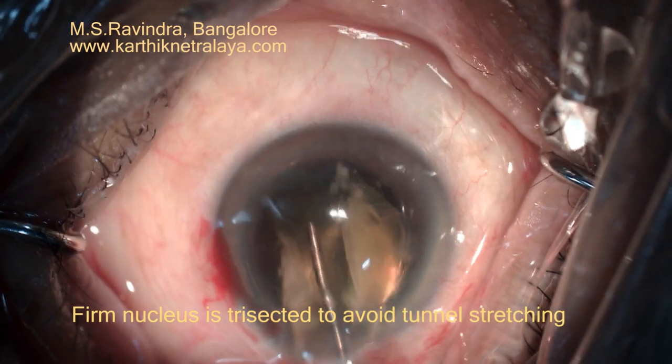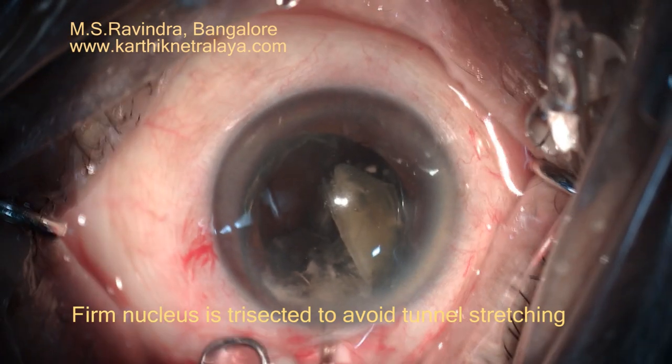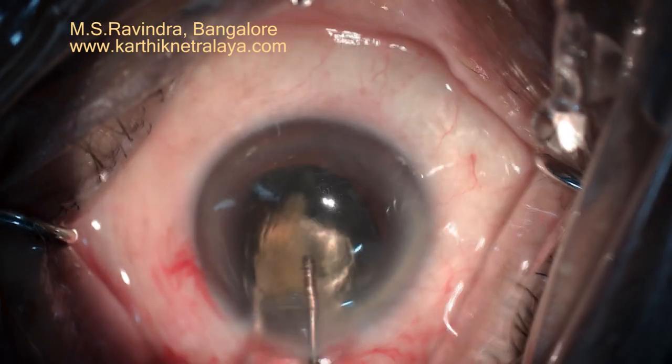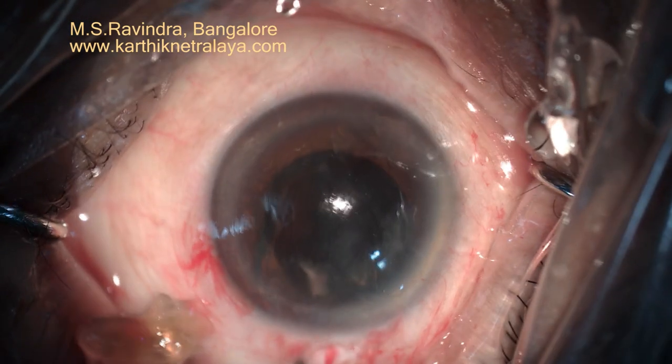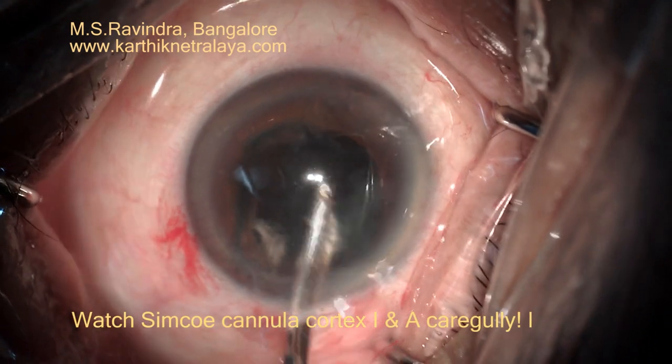The hard central part of the nucleus is again removed. Visco is injected through the cannula continuously so as to maximally protect the endothelium. At no point of time does the nucleus touch the endothelium.